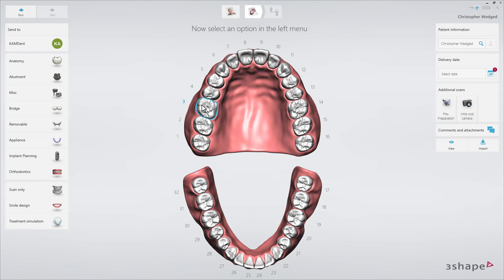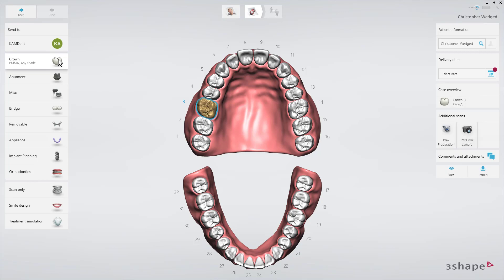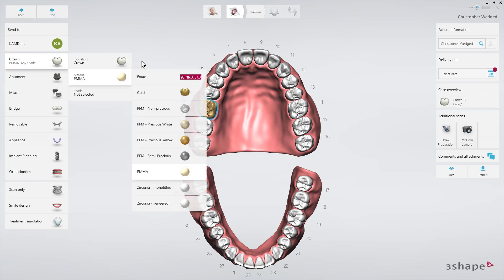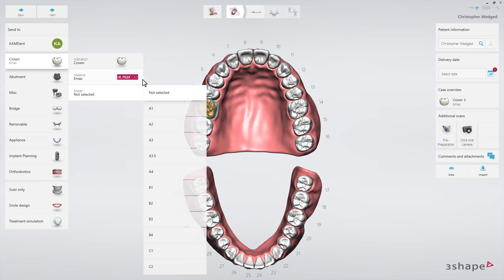Select a tooth, then select the indication you need and fill in the specifics — for example, material and shade. Options will vary depending on the type of restoration selected.